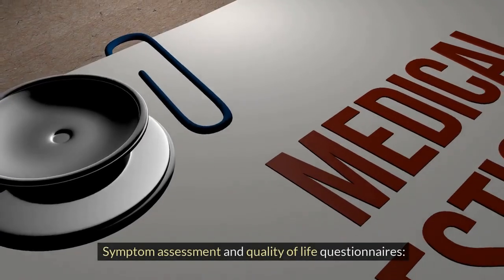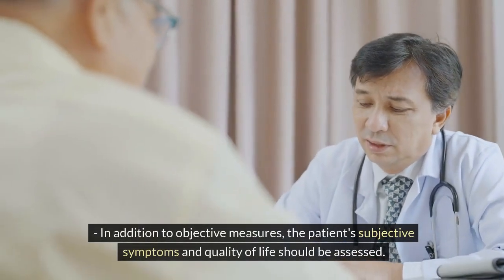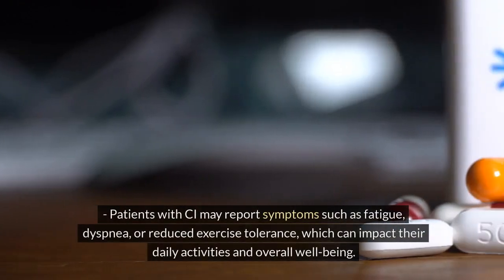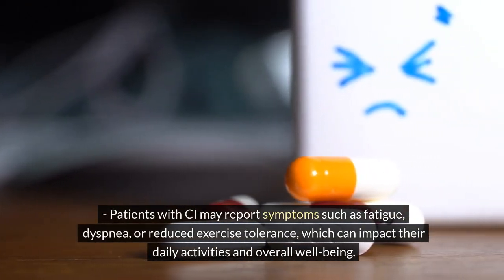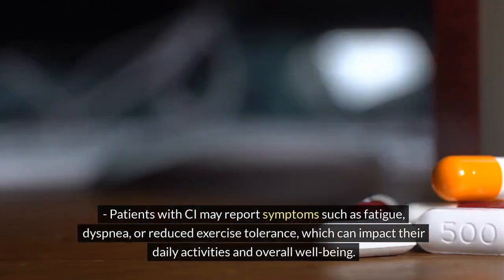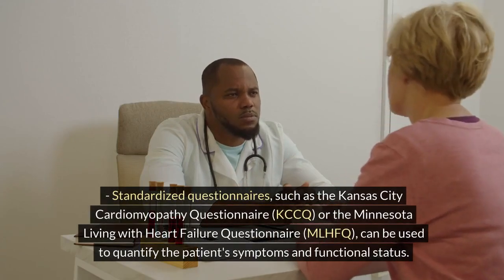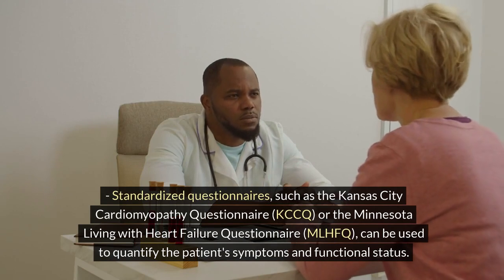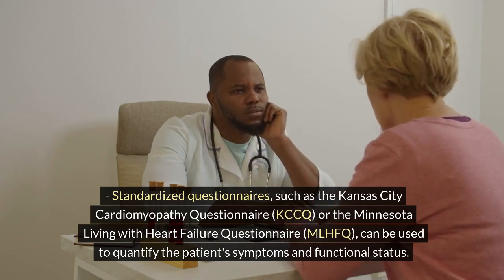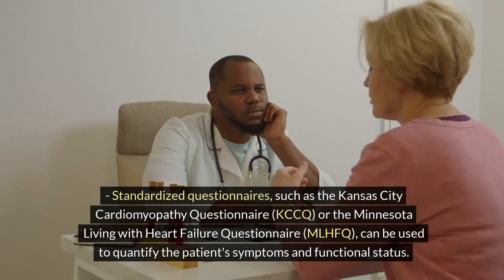4. Symptom assessment and quality of life questionnaires. In addition to objective measures, the patient's subjective symptoms and quality of life should be assessed. Patients with CI may report symptoms such as fatigue, dyspnea, or reduced exercise tolerance, which can impact their daily activities and overall well-being. Standardized questionnaires, such as the Kansas City Cardiomyopathy Questionnaire, KCCQ, or the Minnesota Living with Heart Failure Questionnaire, MLHFQ, can be used to quantify the patient's symptoms and functional status.